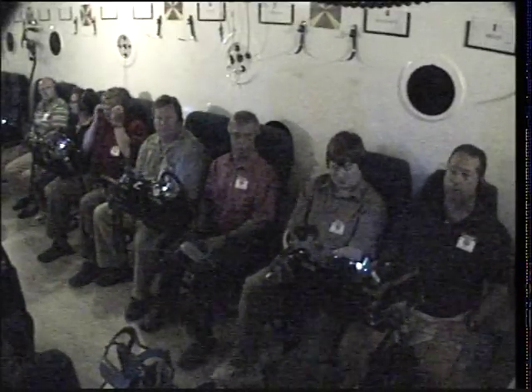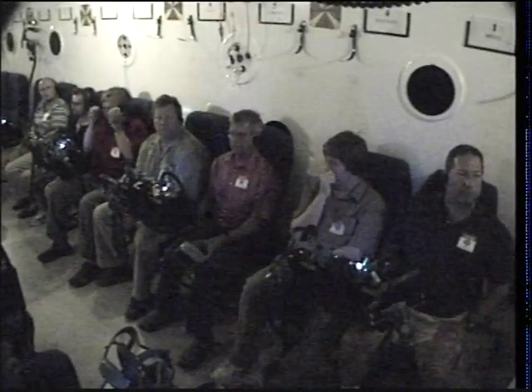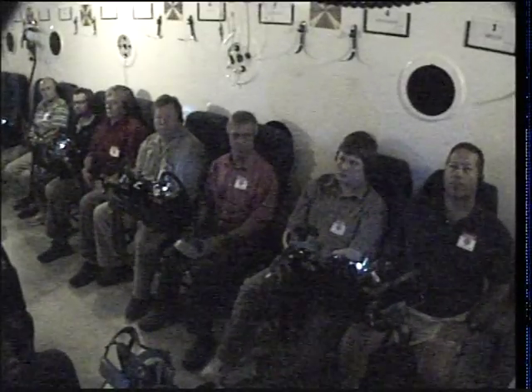What is going to take place? Well, part of it has already been done for you. We turned the lights down, and things got fairly dark initially, but it doesn't take long for them to brighten up. Why? Because we're dark adapting. And over the first 3 or 4 minutes, you're going to dark adapt quite a bit.